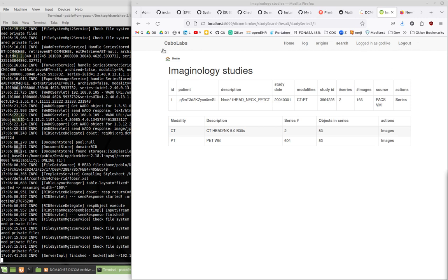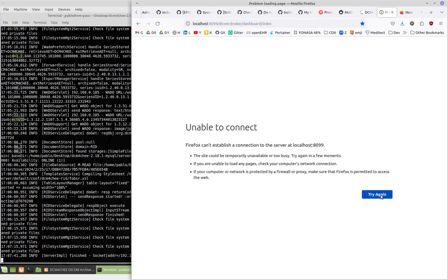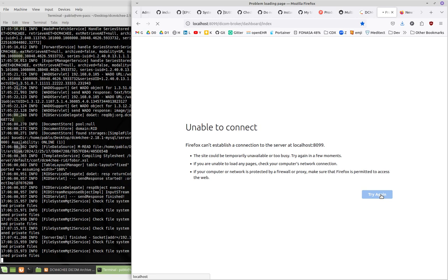Let's see if this is still coming up. It will take a minute. I don't remember if we are actually caching some of the responses from the server. That is why I didn't get the structure report when I search again. That might be the case.